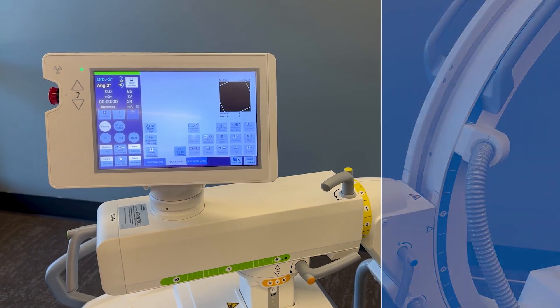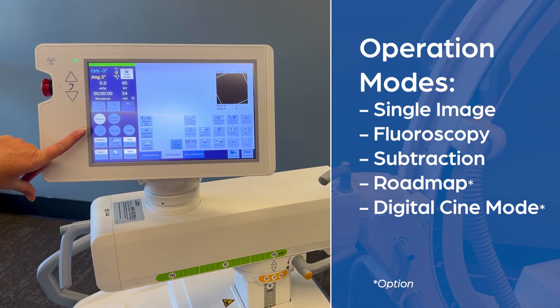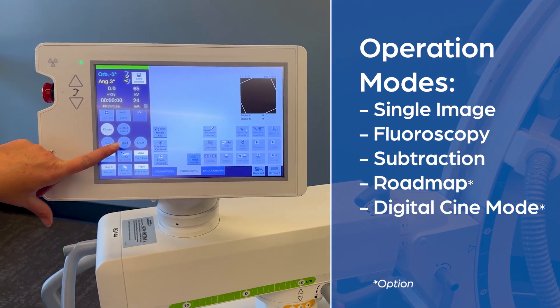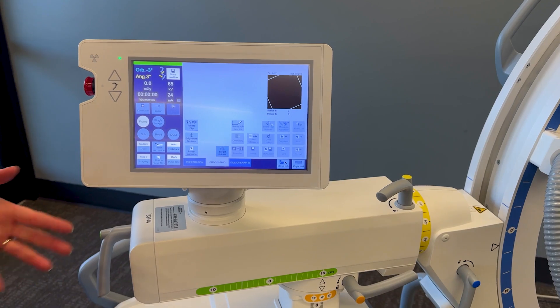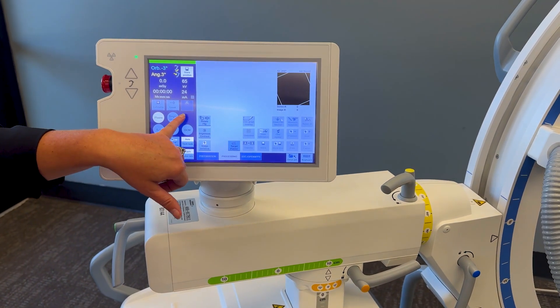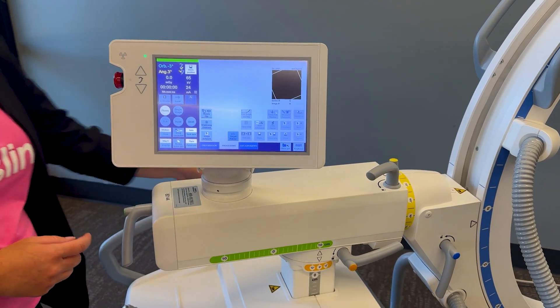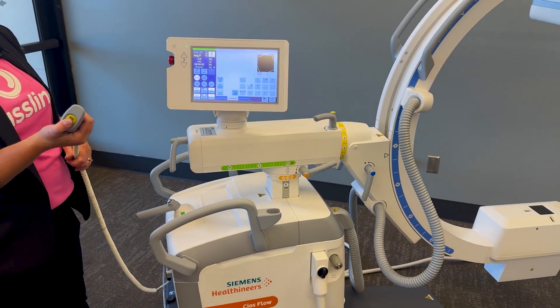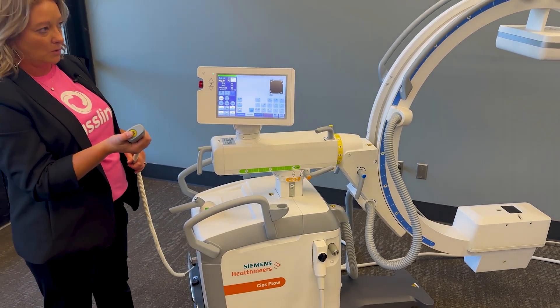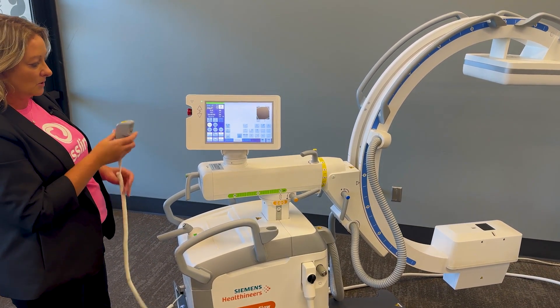This system can do simple vascular procedures, so it does come equipped with vascular software, subtraction, road mapping, and digital cine mode. All of our C-Arms are equipped with fluoro in single image and your basic cine fluoro. To do that, you would just hold down your fluoro button and record that cine loop, then hold your save button to acquire that cine loop.